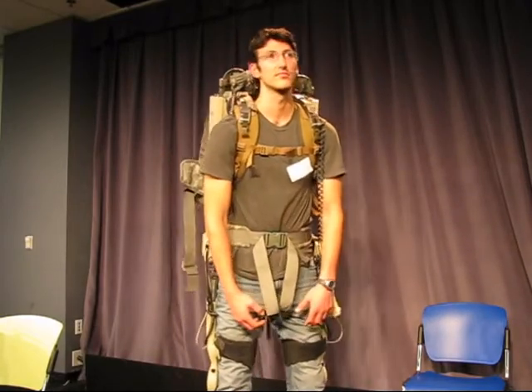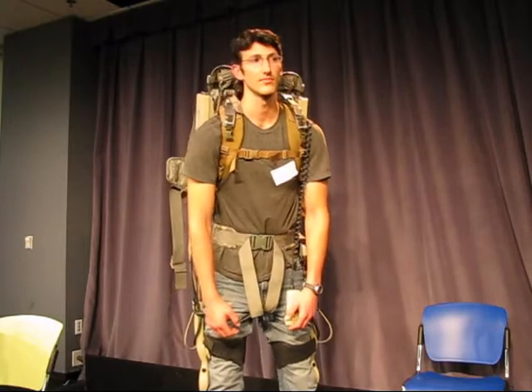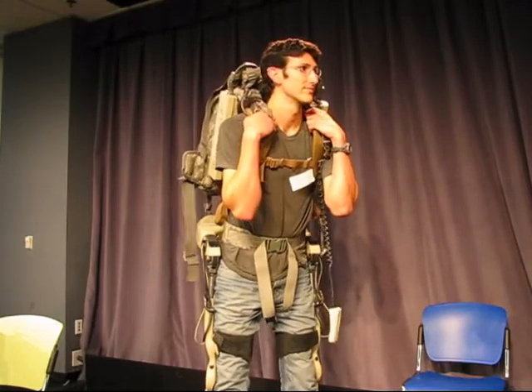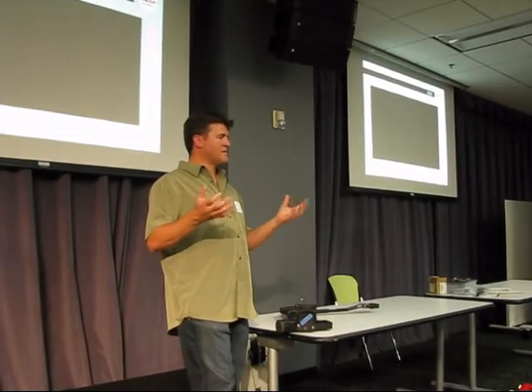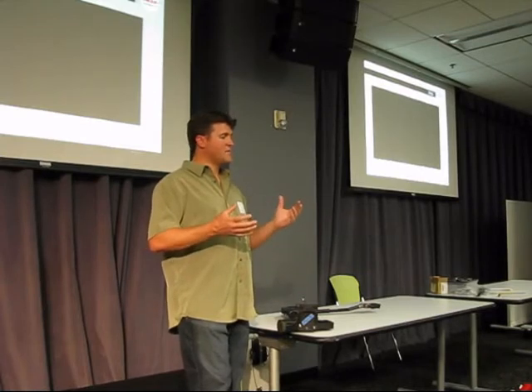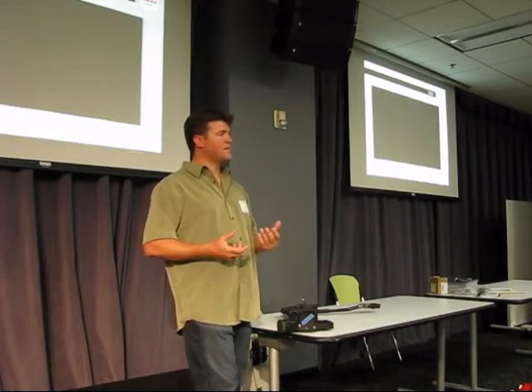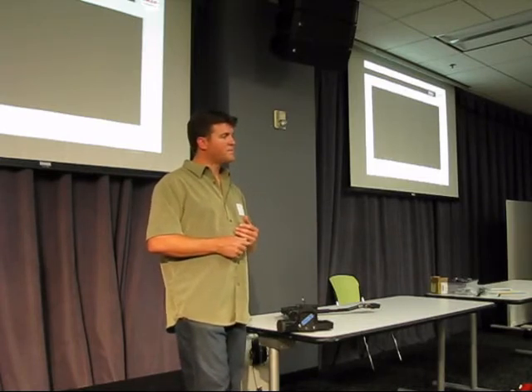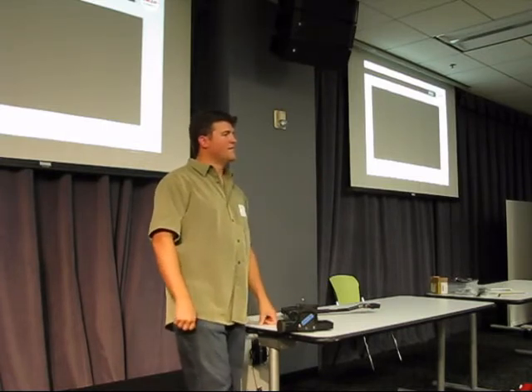If a paralyzed person uses this, will he eventually be able to drive a car? First, the paralyzed person would use our electric Exo. Right now, a paralyzed person uses hand controls to drive a car. So the idea is eventually when we go to a personal type of Exo for SCI patients, to make it custom fit to the individual, get rid of the adjustments, which adds bulk, to where we can get it small enough that they can actually sit in a car with it on. They put controls on the steering wheel. I don't think we would want to trust the Exo yet for pushing the throttle.